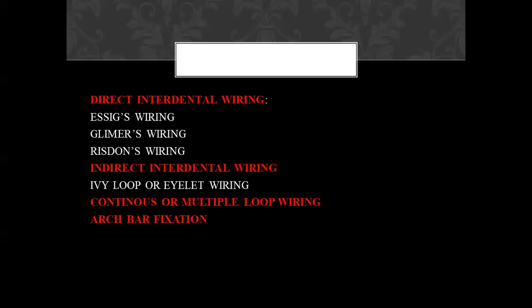Whereas non-rigid fixation does not prevent interfragmentary mobilization. There is mobility of the osseous segment during active use of skeletal structures following the application of internal fixation. So this is non-rigid fixation. An example of non-rigid fixation is intraosseous wiring. So remember, in rigid fixation we are able to prevent interfragmentary motion, whereas in non-rigid fixation we are not able to prevent it.